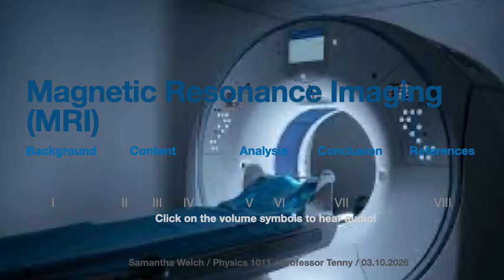By utilizing strong magnetic fields, radio frequency waves, and the behavior of hydrogen nuclei, MRI scanners can create very detailed images of the body without needing to use harmful radiation or surgery. MRI technology also shows how discoveries in physics can lead to innovations that improve treatment, patient safety, and medical diagnostics.